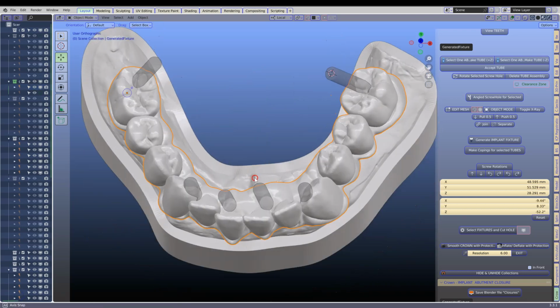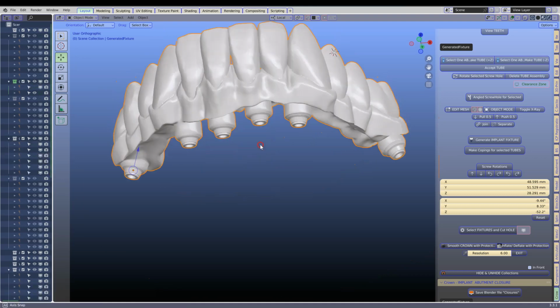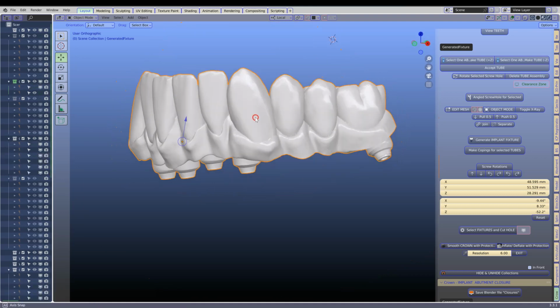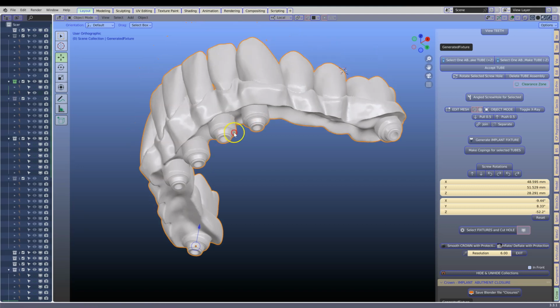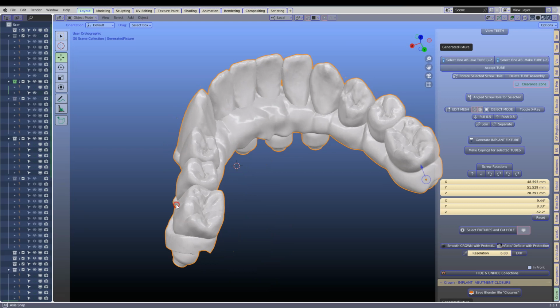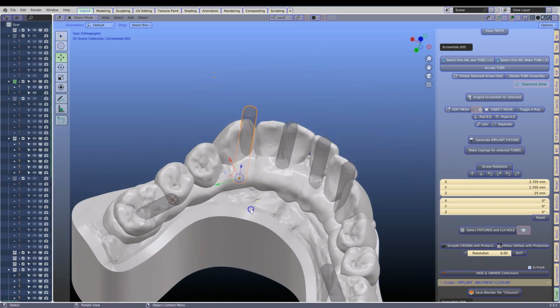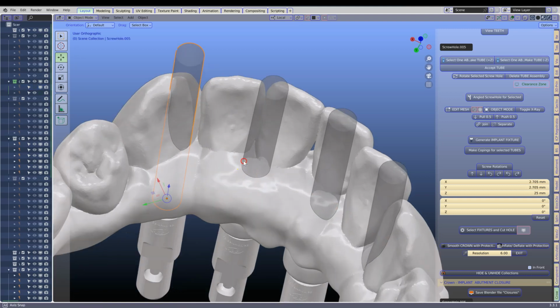I'm going to make screw holes going through this hybrid. Now we have cut the gum, the tissue. We have also connected the implant abutments to the hybrid. So here, this is really cool stuff actually. I'll show you what we're going to do.